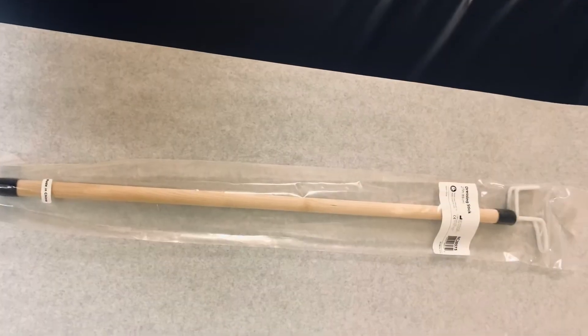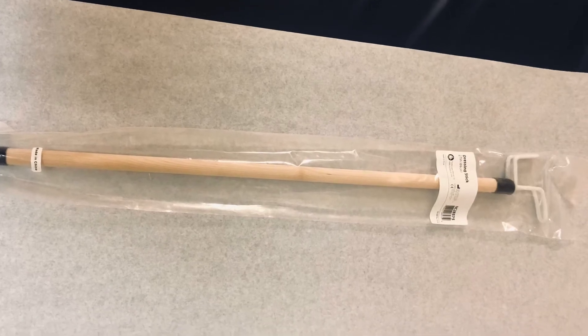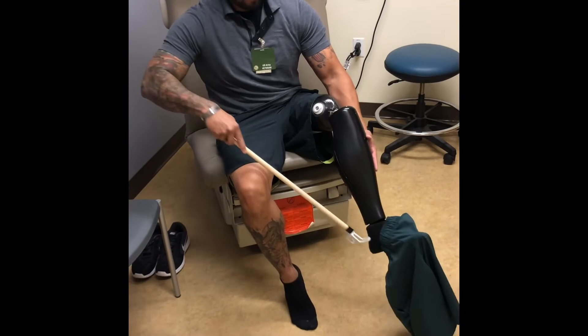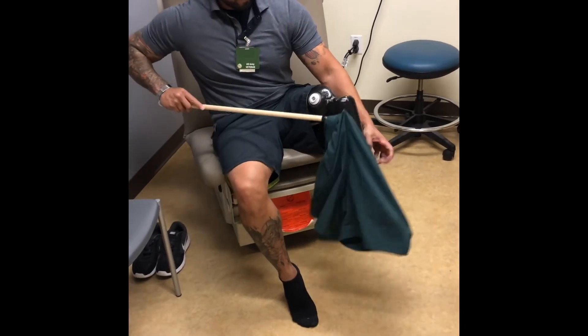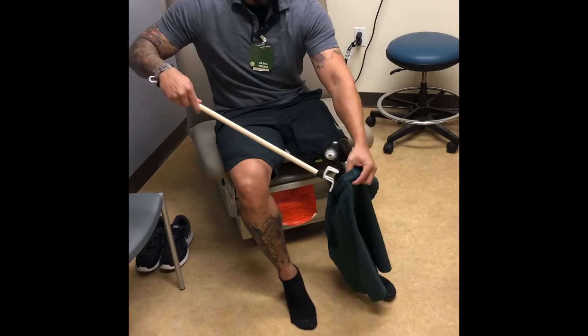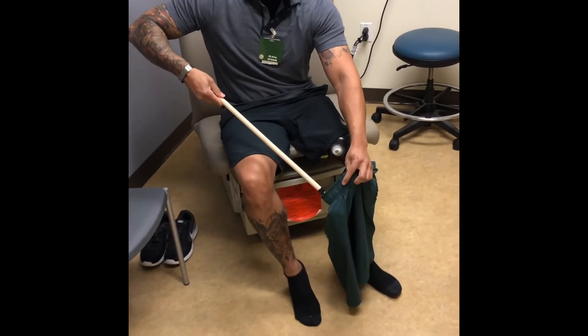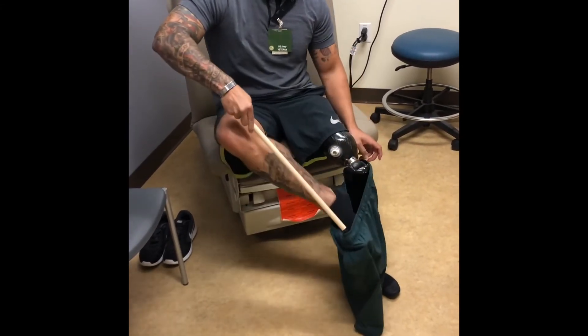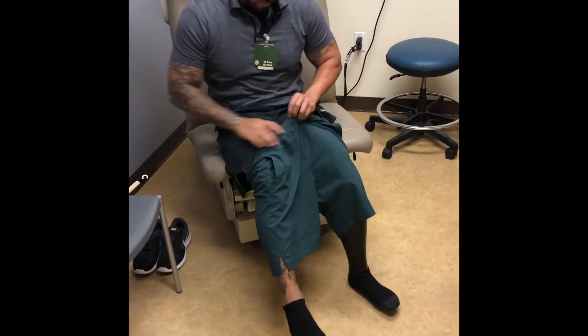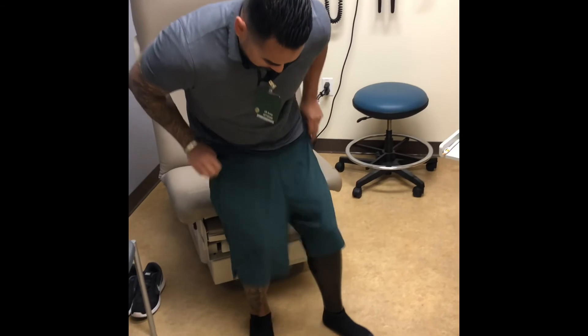The last adaptive equipment we have is a 27-inch dressing stick. The bottom end of the 27-inch dressing stick is used as a fishing hook to go ahead and slide your affected leg through your shorts or pants. Then you're going to use the same end to slide the other foot through and lift your shorts or pants up to your waist.